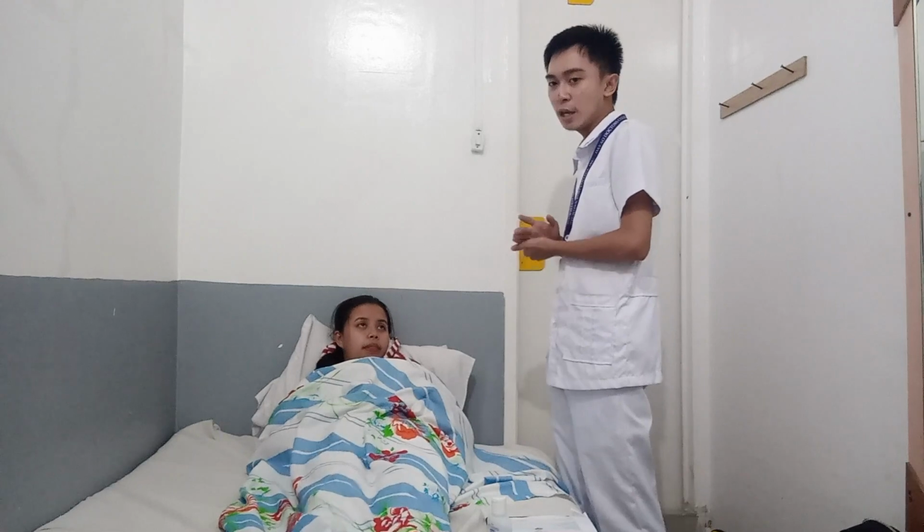Yes. Okay, good. Now I will close the door so no one can disturb us while doing this, okay? Assist the client to a position in which the arm, leg, or abdomen can be relaxed, depending on the site to be used. Obtain assistance in holding an uncooperative client. After that, I'm going to assist my patient into a comfortable position with the arm, leg, or abdomen relaxed, depending on the site to be used. Obtain assistance holding an uncooperative client.